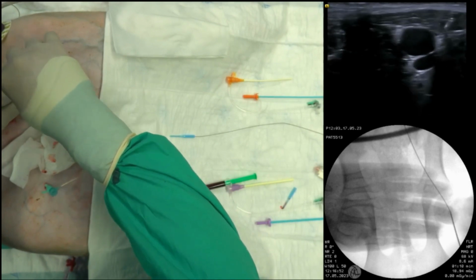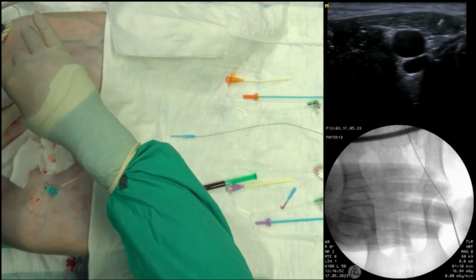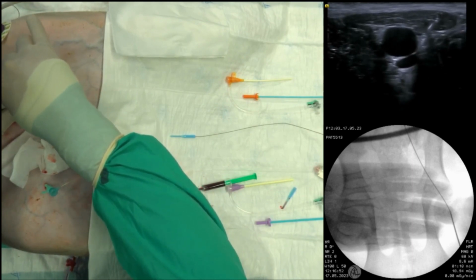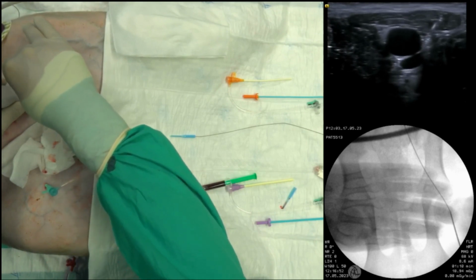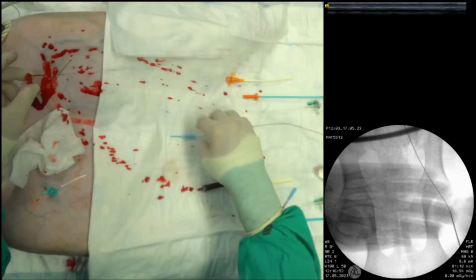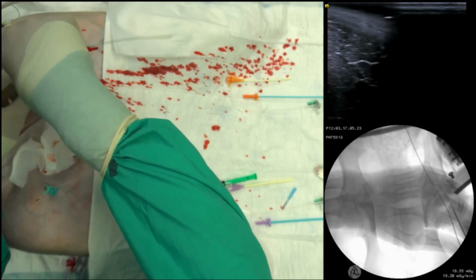So before placing the venous introducer sheath, we get the second guide wire in the artery first. To do that, we use a needle without the syringe so that we can see blood flow coming out of the needle when we are inside the artery. So we first puncture the thick skin that the pig has, and then we try to perforate the artery in its anterior wall, which we've just done. And as you see, there is a lot of pulsatile flow, which is a good sign that we are in the correct position in the arterial lumen.